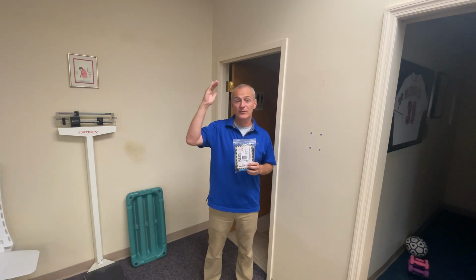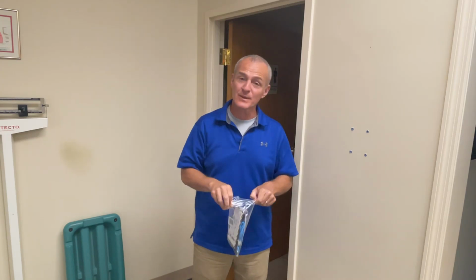So in this video, I'm going to show you how to set up your new shoulder pulley system. This is the RangeMaster shoulder pulley. It's an over-the-door pulley system, but I'm going to show you how we can set it up at different levels in case you don't have the range of motion or you can't reach over the door frame. The pulley system comes with instructions.